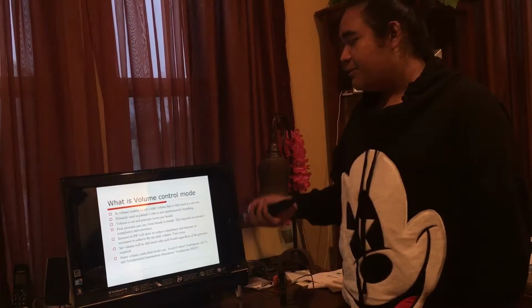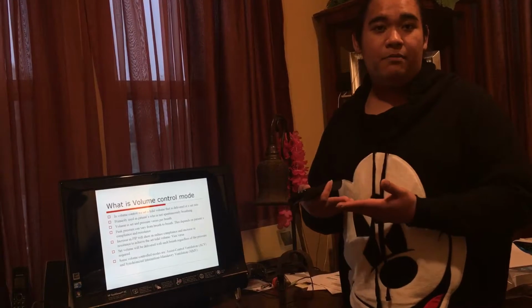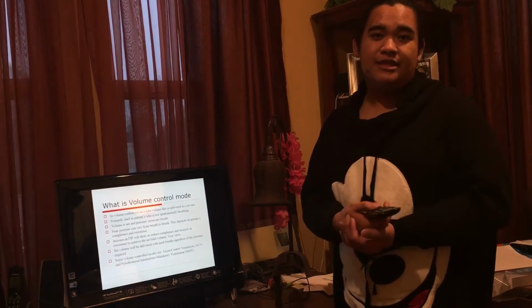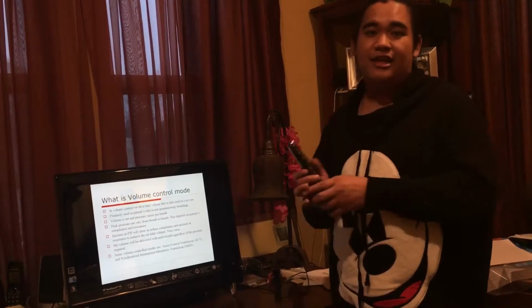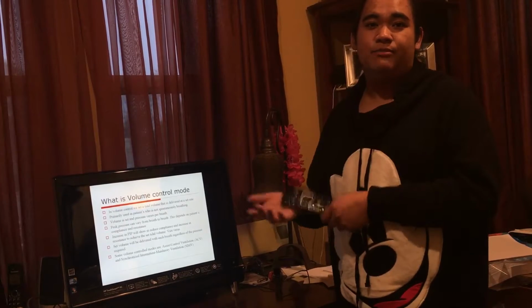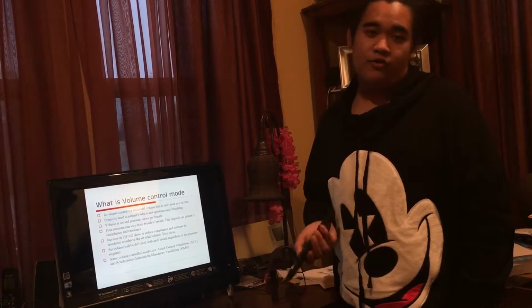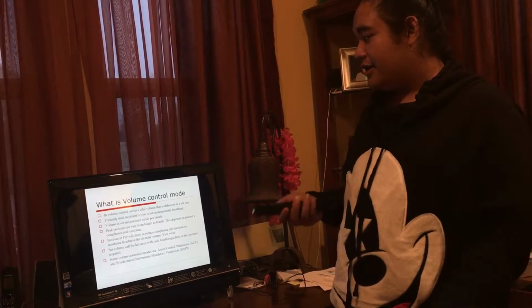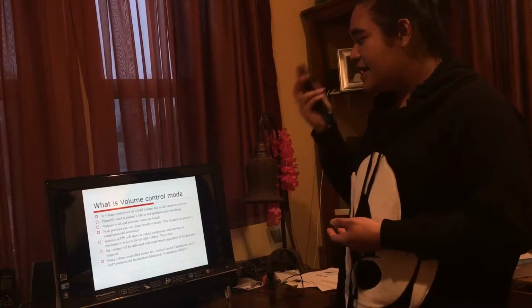So this is primarily used for patients that can't spontaneously breathe, or patients that are sedated, but that doesn't mean that we can't use this for patients that can spontaneously breathe. It's basically saying here that we use this more often for patients that are sedated or can't spontaneously breathe. Volume is set, as we said earlier, and the pressure will vary between breaths.